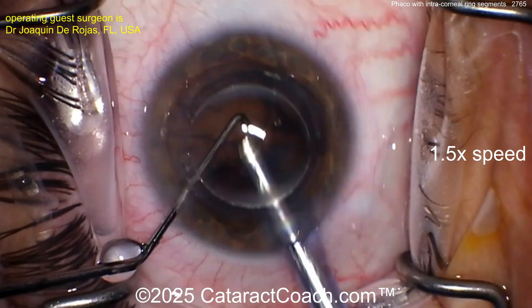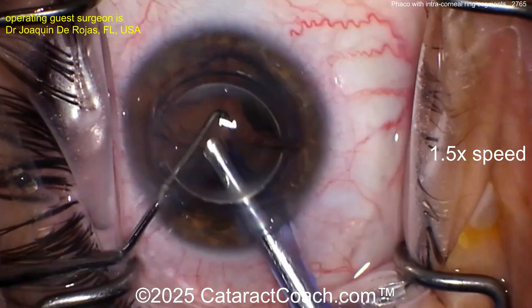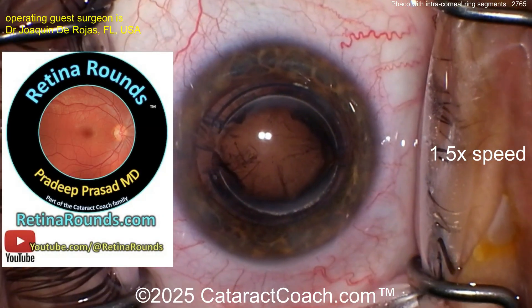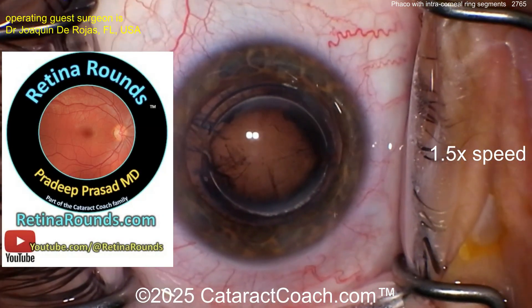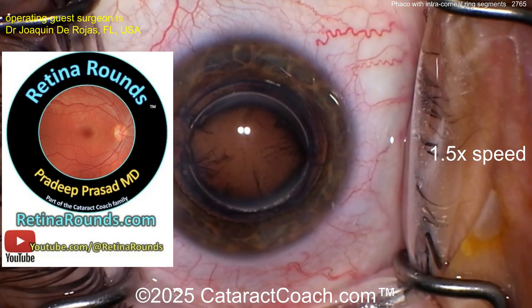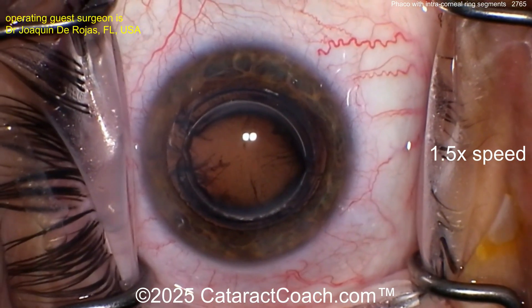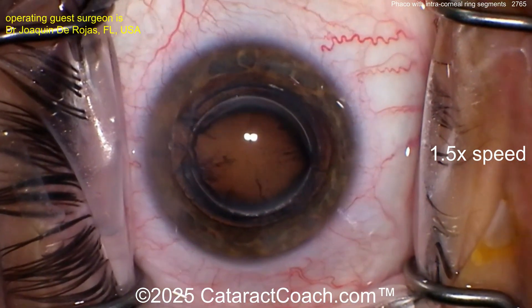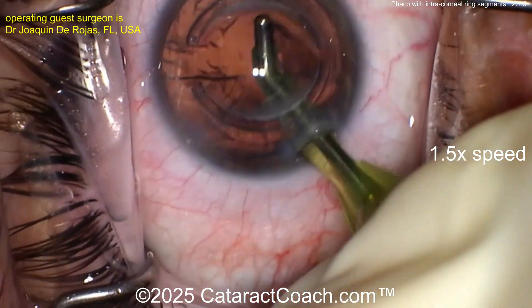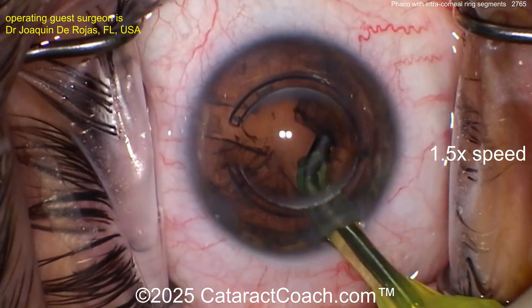As this starts to come down you'll see more of that red reflex. The lens calculations are pretty much normal in this case. Be sure to check out retinarounds.com — our sister channel and the world's best resource for everything retina.